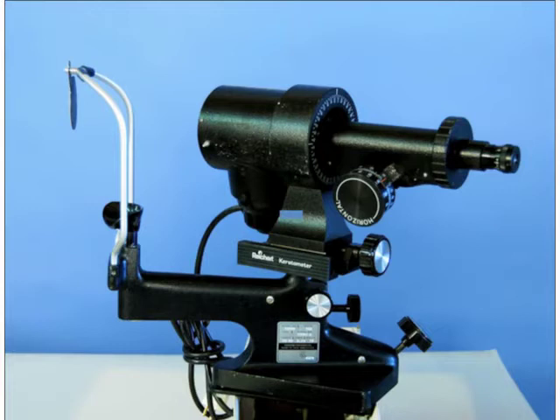Now, there's an assumption that this sort of keratometer makes, which is largely true for most normal corneas that have not had surgery, that the meridian of greatest steepness of the cornea is orthogonal, is perpendicular to the meridian of greatest flatness of the cornea. And I'm going to represent to you that that's not universally true, and we're going to see some examples in which it is clearly not true.